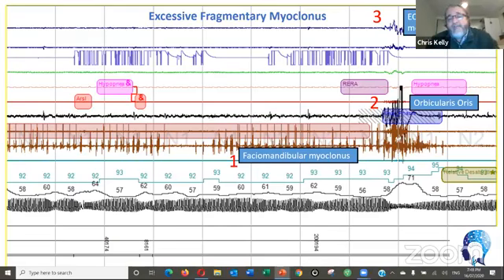In this patient you see that it says blue, I think you can just read it says Brux phasic on it, and that's around the orbicularis, I've written Orbicularis there. And just above there is number 2. That's the chin, showing that the mouth is opening and then the teeth are chattering. Everything's all wrong. Everything's out of sync. You know what I mean? Everything's out of sync.